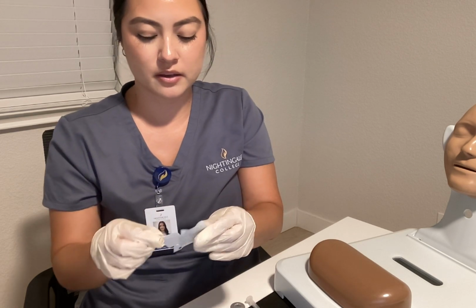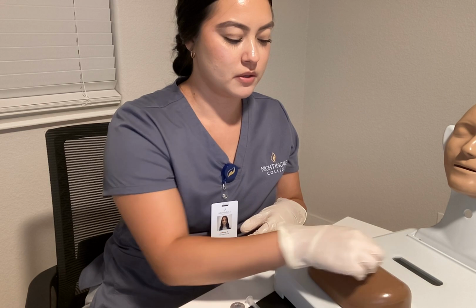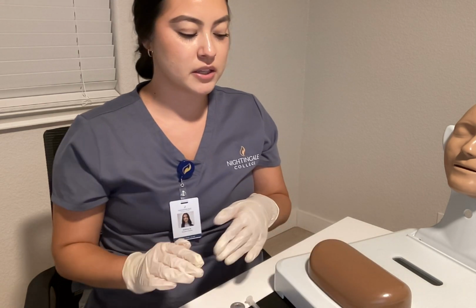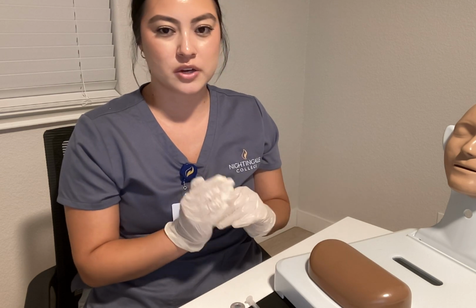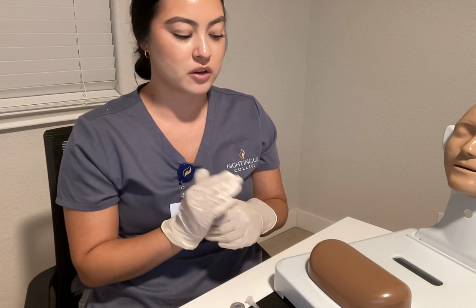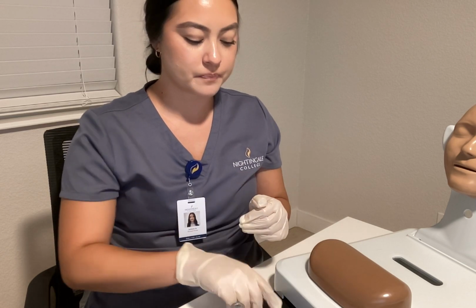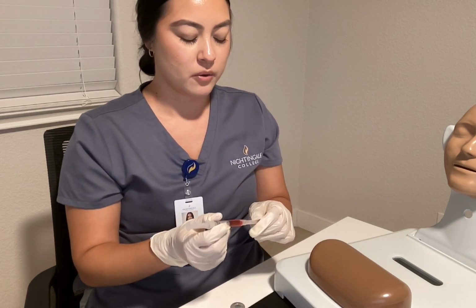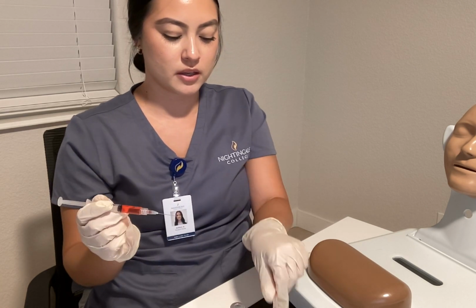Once we have verified this is the correct area that we're going to inject, we are then going to cleanse the area in a circular motion. Once that is cleaned and we have thrown away everything, we are just going to let this air dry. You're not going to fan it, you're not going to blow on it, you're just going to naturally let it dry.